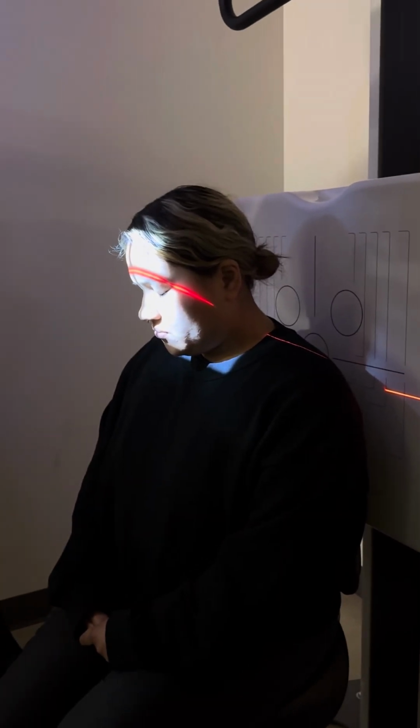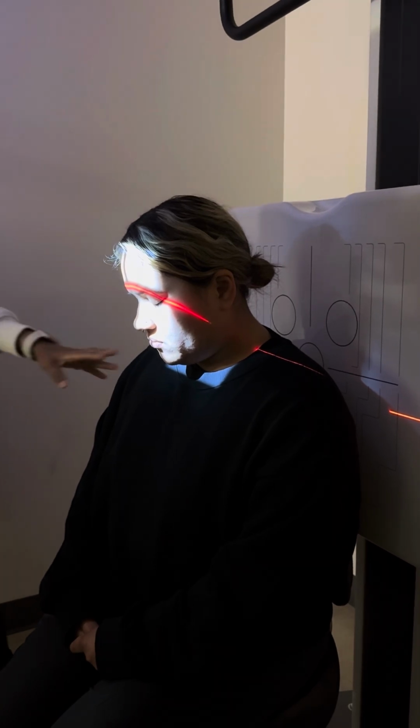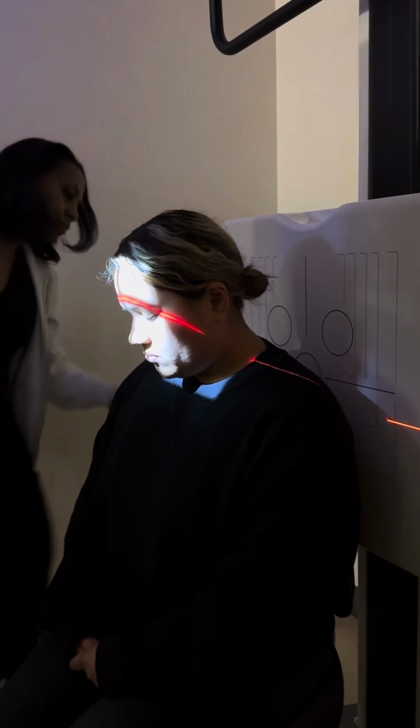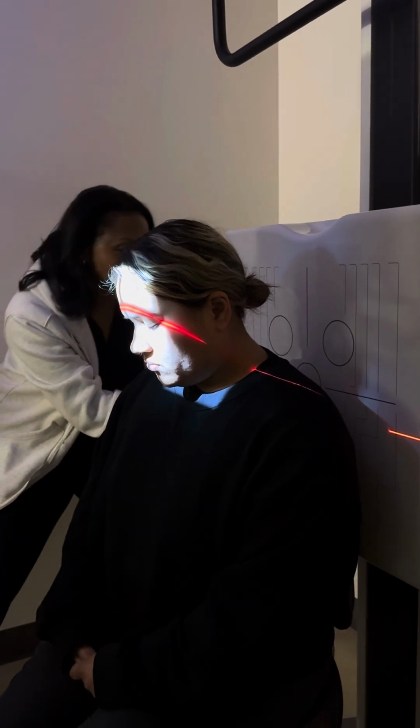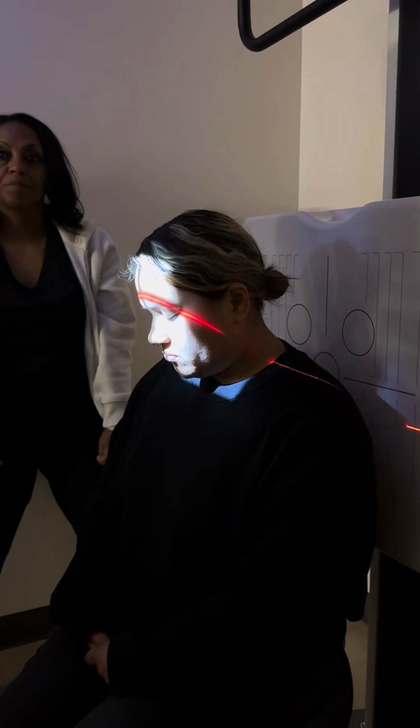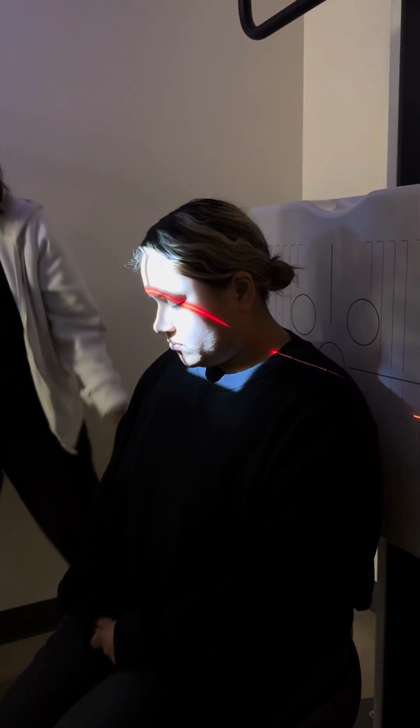You'll get it. You're all doing really well. It's clear at the end of the semester you all have a real command of using the device. Mr. Hollis, remember, doesn't know how to use the device clearly, so don't let me touch the equipment while you're working with it. I just bring it out of detent, screw it up. It's not worth playing that game with me. Good job. I can't see whether she's mid-sagittal, but you are hitting the right spot.